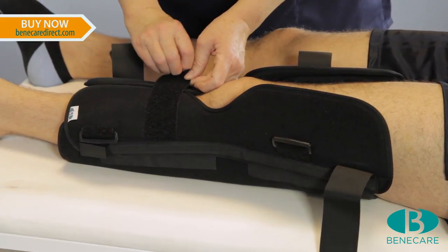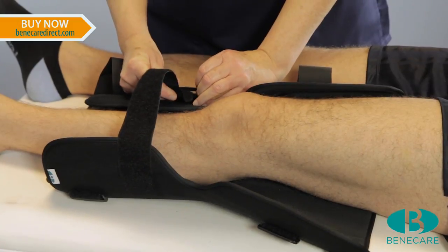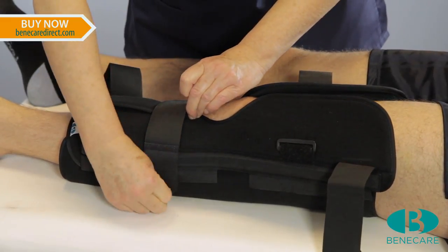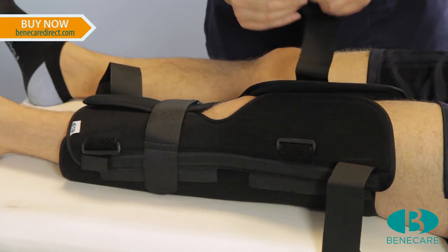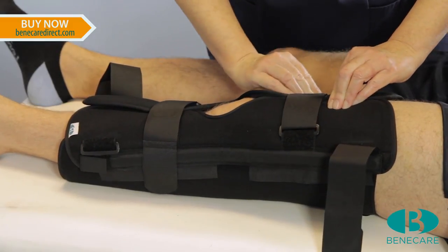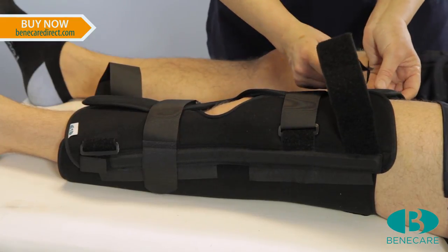The kneecap should be exposed in the centre of the splint. Start with the strap just below the knee, followed by the strap just above the knee, and then continue with the two straps on the extremity of the splint.